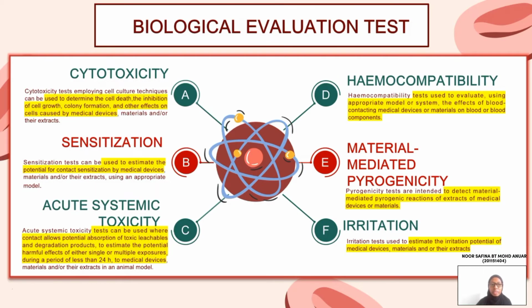Since it is exceeding 30 days, it is a long-term exposure medical device. Biological evaluation tests: we have cytotoxicity, sensitization, acute systemic toxicity, hemocompatibility, material-mediated pyrogenicity, irritation, and many more. So I will go through them one by one. Cytotoxicity is used to determine cell death, the inhibition of cell growth, colony formation, and other effects on cells caused by medical devices.